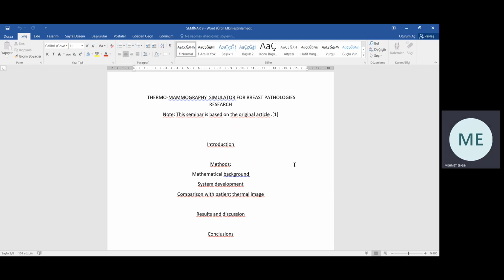In this study, it is proposed the design and construction of a programmable thorax model to promote the use and confidence of healthcare professionals in infrared thermography as a pre-diagnosis tool. This simulator device could be used in training for thermography operators. The aim is to display a simulation of normal and abnormal thermal morphologies, facilitating thermographic analysis for early breast pathology detection.